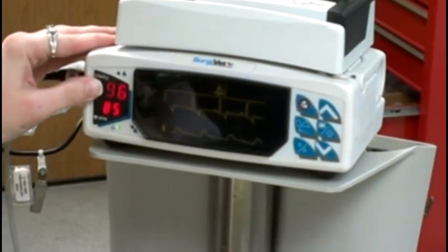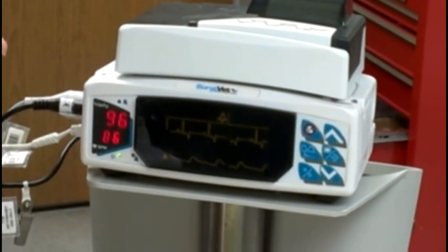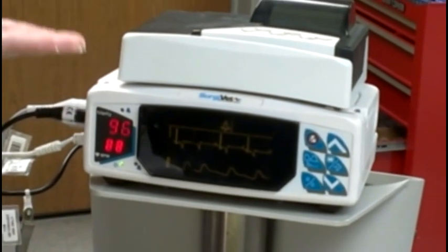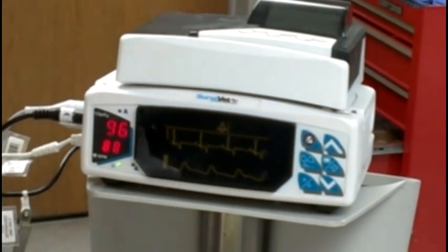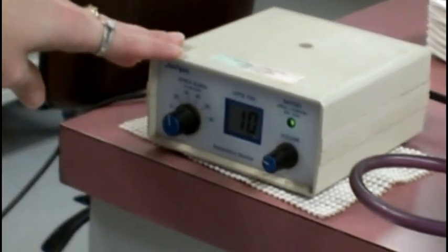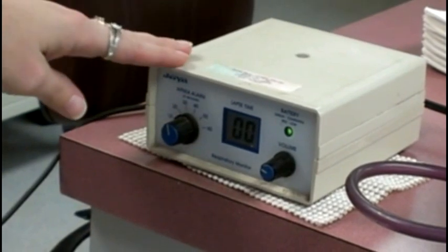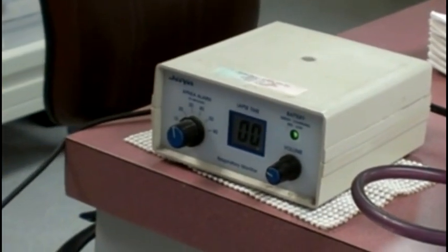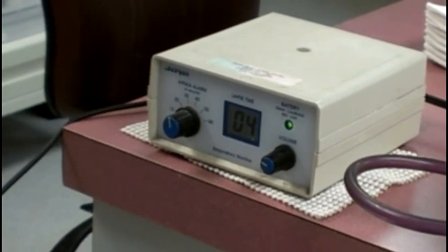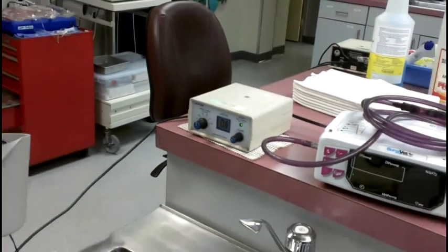Her pulse oximeter, or her oxygen saturation, we want that to be above 95% since she is on oxygen as well as the inhalant anesthesia. 96 is really good. The respiratory monitor beeps every time she breathes. We want her to breathe no less than twice a minute. 3 to 4 times a minute is great. So she's breathing roughly every 10 to 15 seconds.